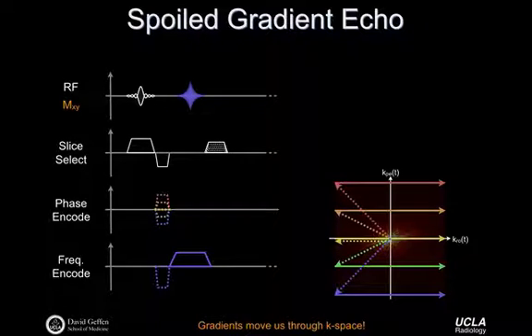So, I was just going to say phase encoding determines the k-y. Yeah, that's right. We should probably be clear about a couple of conventions, because unfortunately there are several. In k-space, the left-right direction is usually called the readout direction. It's also called the kx direction. We take that as the x direction conventionally, and usually when we're talking about reading out, the echo is forming as a function of time along the x direction. And then the up-down direction we take here is the phase encode direction. Obviously, where we are on that axis is governed by the phase encoding gradient. More simply, sometimes it's just called the ky axis, k subscript y.